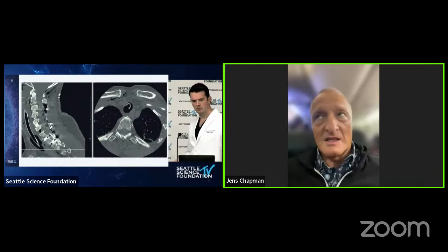Nonetheless, I think we still had the problem from the overall height restoration. So I'd be curious to hear other thoughts, but this is a temporary frustration. It fortunately is totally resolved, and she's extremely happy now. And I feel it's resolved her myelopathy also. But it does show how sensitive it is, and when you use neuromonitoring a lot, how helpful it can be. I'm not sure what I should have done differently or if I could have totally avoided it. So I'd be curious to hear your thoughts.